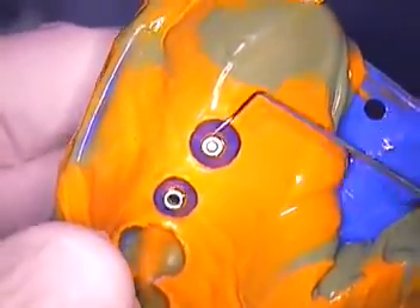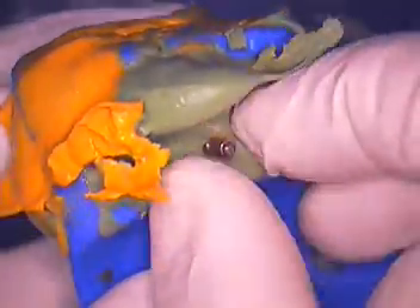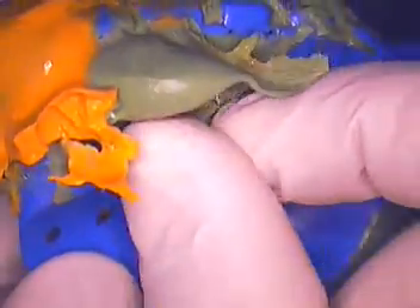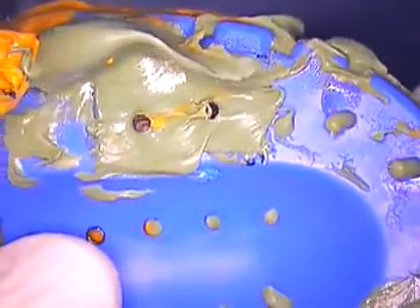So get the screws out of there — it just takes time to do it in the mouth, but patients are usually pretty cooperative unless you've got a real tough gagger. If you did have a tough gagger, then you're going to be stuck doing a lot more procedures with a closed tray. Open tray is the way — unless you're scanning directly in the mouth — and for me it's been the hallmark of my success, with cases having absolutely no adjustments, hardly, with contacts or anything of that nature.